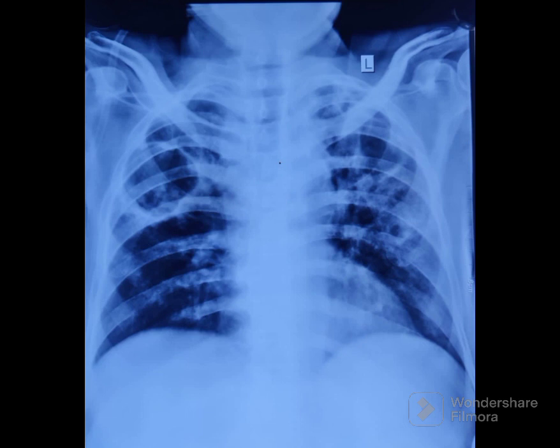Look at the cavity wall characteristics. Malignant etiologies tend to have irregular internal walls and outer wall speculations. Benign lesions tend to have smooth walls. In general, malignant lesions tend to have thicker walls and benign lesions have thin walls.